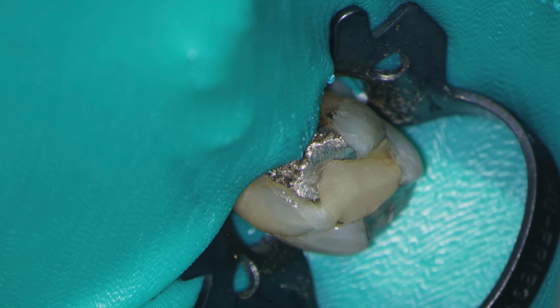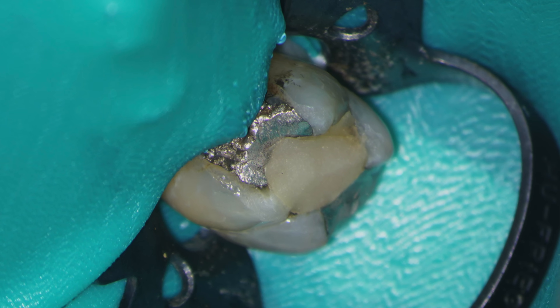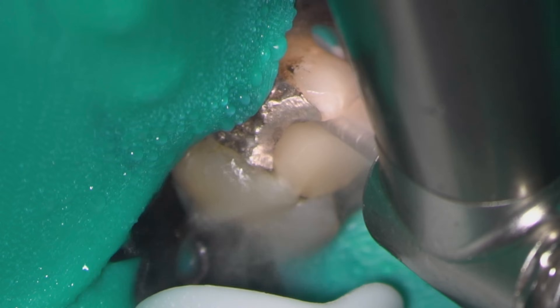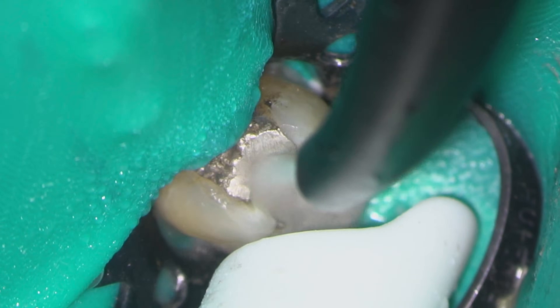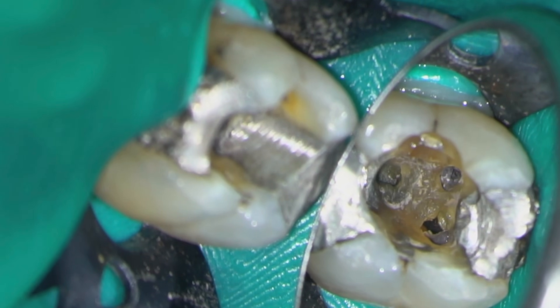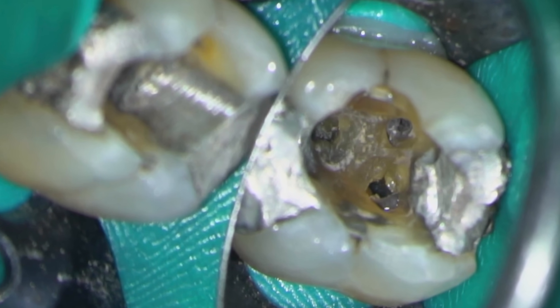Here we have our mandibular molar isolated with rubber dam, using a black number 14 clamp. Using a long tapered diamond burr, I'm just removing the temporary restoration. As we finish that off, I hit a big ball of cotton wool. Our first peek into the access cavity with the microscope reveals that the roof of the pulp chamber is still in place, and the previous root filling has been carried out through either pulp horns or little perforations in the roof.